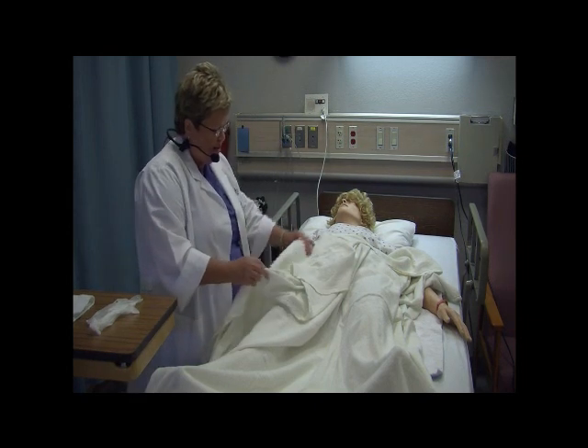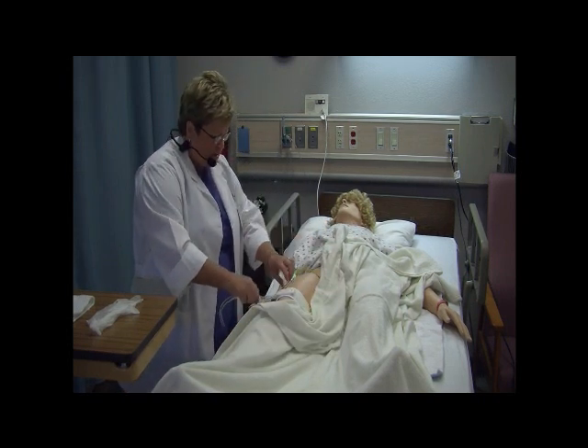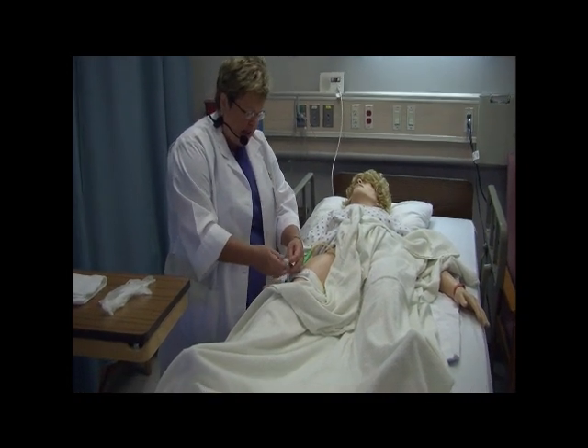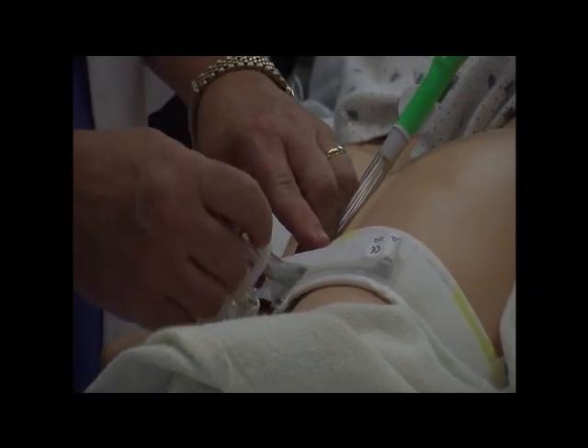All right, let me uncover this catheter. I'm going to take the catheter and I'm going to pinch the tube, and this little appliance I'll place around the tube so it'll hold it crimped. That way, urine will pool in this area for us.